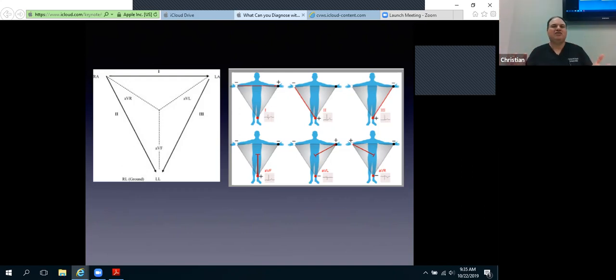So this is where in lead 3, the signal tends to be isoelectric. Isoelectric meaning that the amount of electricity on the positive side is balanced by the amount on the negative side. It doesn't mean that it's a flat line. It just means that if you were to measure how much electricity is moving towards you, in a normal EKG, it should be slightly more positive than the amount of negative that's there.